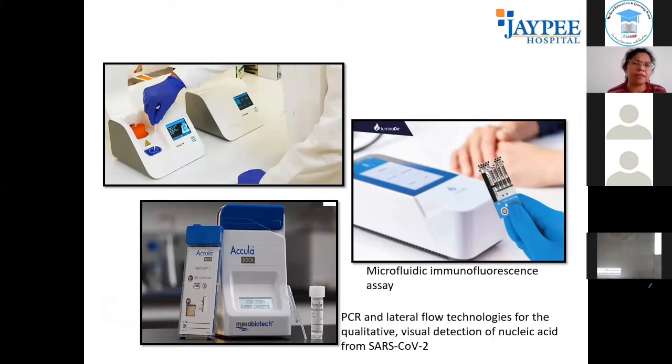Now we all would have seen the demo or would have read about it. This was able to give your RT-PCR, your PCR results within 15 minutes during COVID, and was very useful for triaging patients and giving a rapid diagnosis, especially during the second wave.